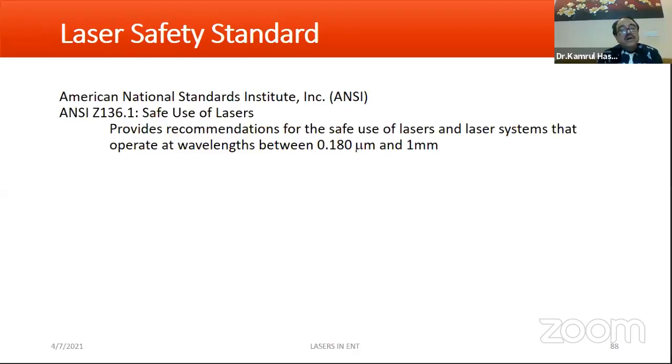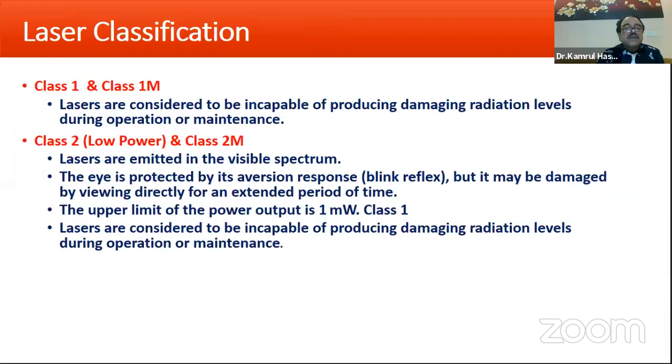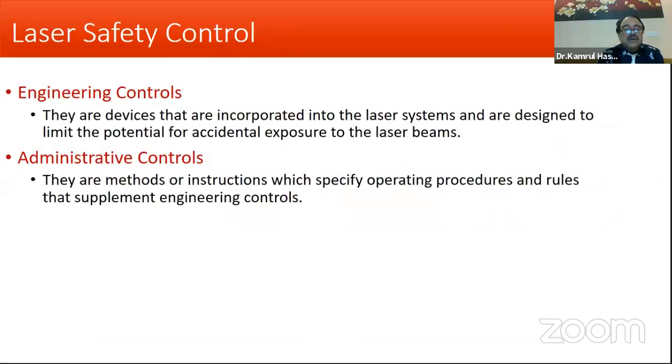As we are using the endotracheal tube, either rubber or Portex or Shiley made, or PVC made, all of these have a greater chance of ignition by the laser. So what should the anesthetists do? They should think of laser safety. Many things we do with the tube. Where there is a danger sign, we should be very cautious.